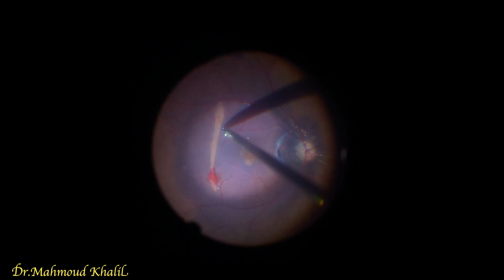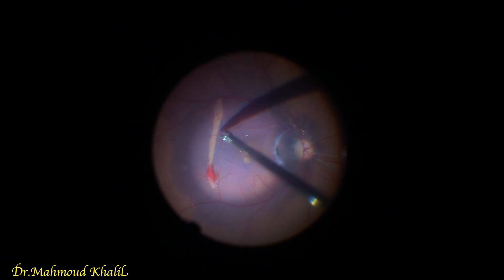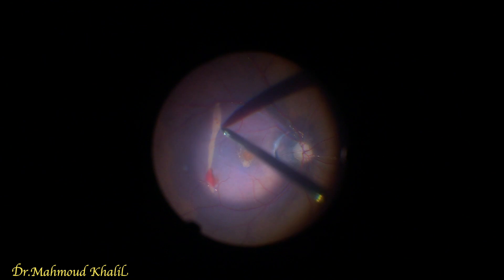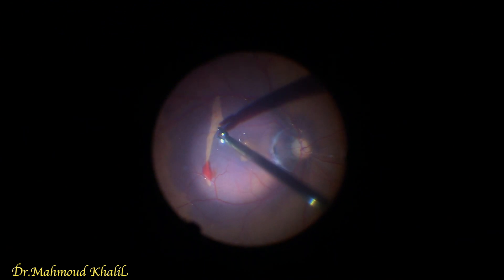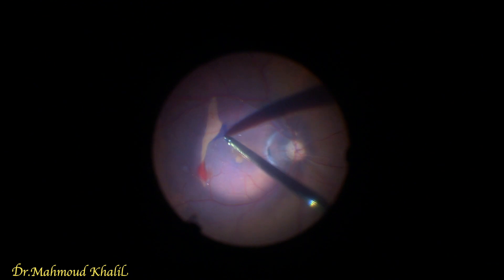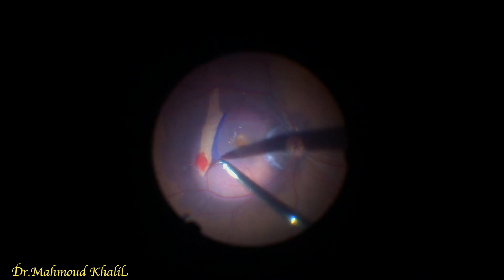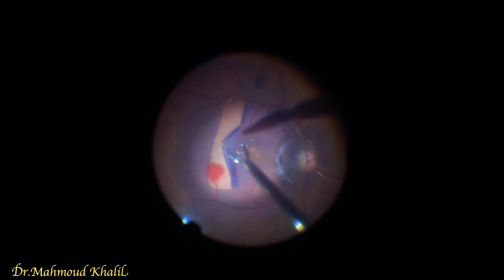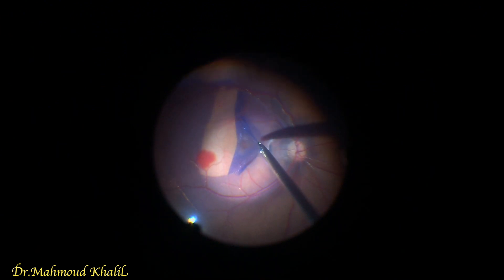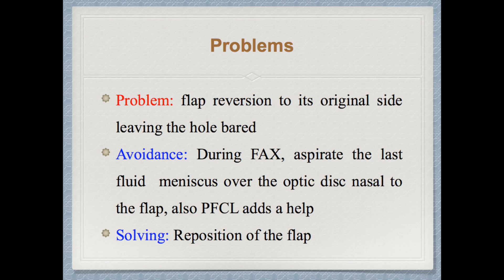Then getting the temporal flap, peeling the ILM at the temporal site, and inverting this temporal flap on the surface of the macular hole. The idea of all these techniques is to make a scaffold. The main problem of the temporal ILM technique is flap reversion to its original site, leaving the hole uncovered.